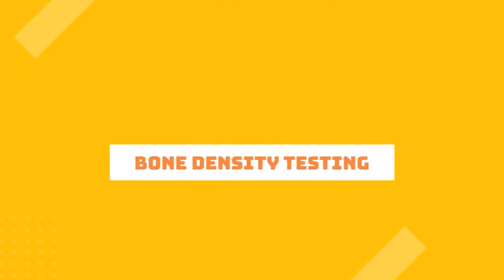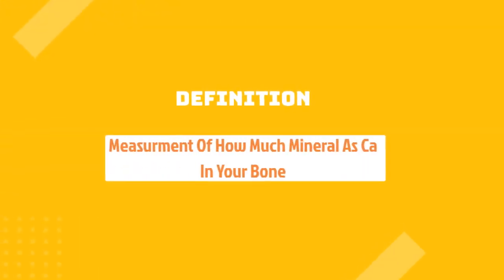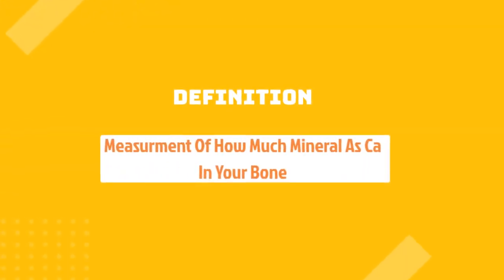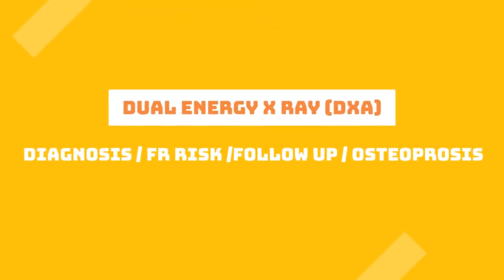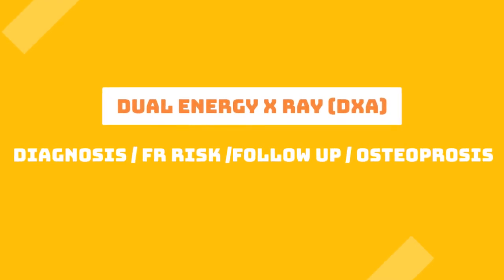Today we will speak about bone density testing. So let's start. Definition: it's a measurement of how much minerals, like calcium, are in your bones. The most common bone density test is the DEXA scan. It's used for diagnosis of osteoporosis, detection of fracture risk, and monitoring the effectiveness of osteoporosis treatment.